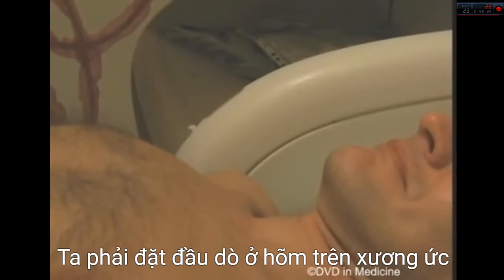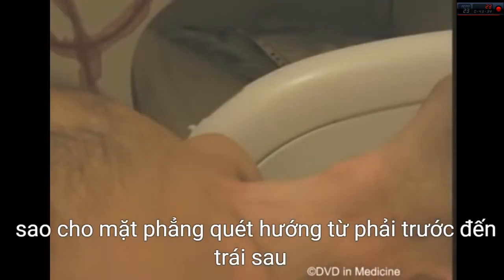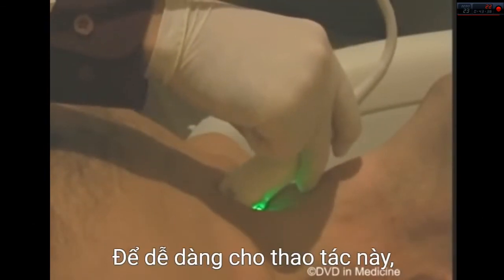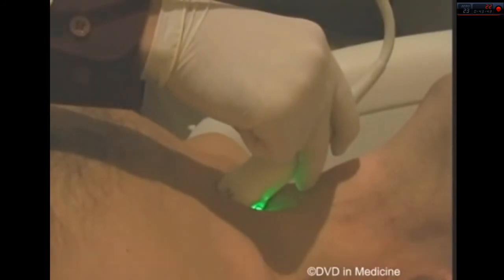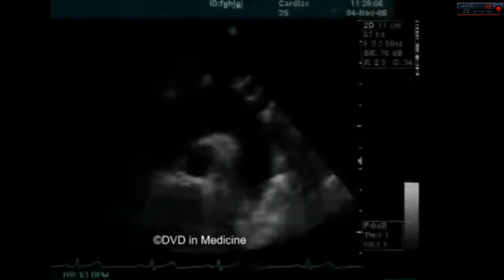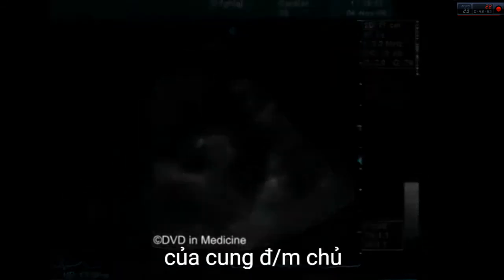One should place the transducer in the suprasternal notch, angle the scanning plane inferiorly and parallel to the aortic arch so that the scanning plane is directed from the anterior right to the posterior left. In order to facilitate this maneuver, one can place a pillow under the patient's neck. One will obtain a suprasternal long axis view of the aortic arch.